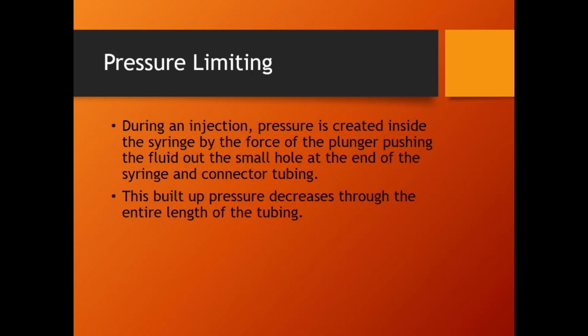All right. This is 300 psi. The angio injector versions of these that I mentioned earlier, they'll go up to 1,000 or 1,200 psi. No, we're not putting 1,000 psi into the patient. Infusion pumps freak out if you get over 10. All right. So it's not 300.